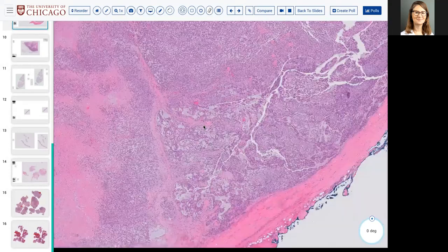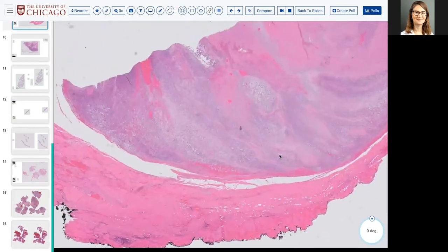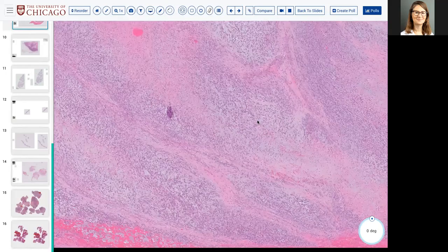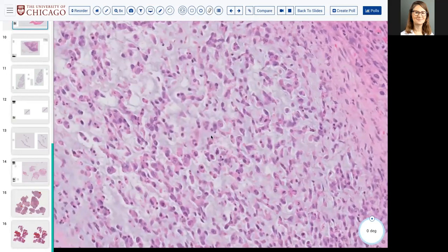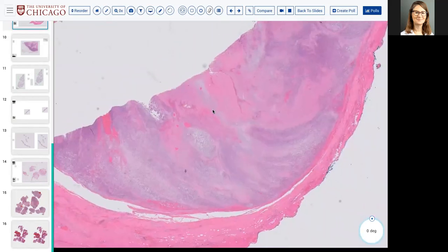So we now see an epithelioid neoplasm that for all intents and purposes is very similar to the others, right? But now has this myxoid-like background. And we want to rely on these morphologic clues to help guide our immunoprofile and our differential diagnosis. I can tell you where this is. It's not going to really matter. This actually ended up being an intraosseous tumor that had completely eroded the bone of the mandible. But these tumors can occur in the bone and they can occur in the soft tissue of the trunk and extremities. So just putting that out there, this happened to be a mandibular tumor.